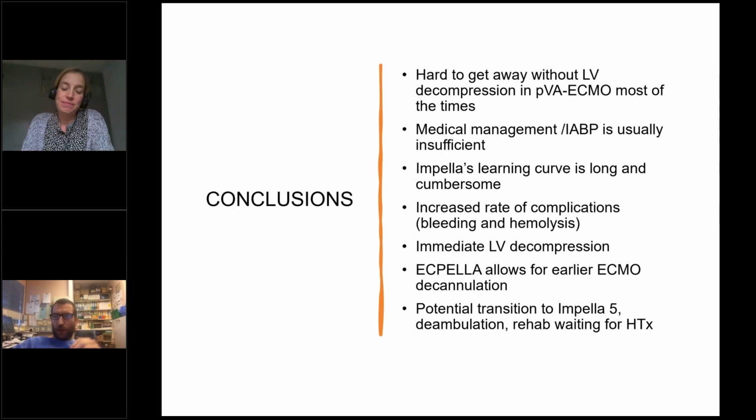Okay. I have a couple more questions there from all different aspects. There's one, Scott Weingart asked if you have any experience if this can be included into an ECPR strategy, because obviously some colleagues do so. Yeah, so we've done it quite a few times in the last year on ECPR.